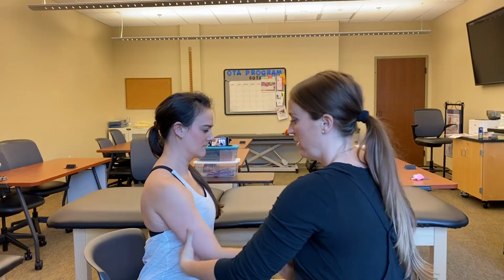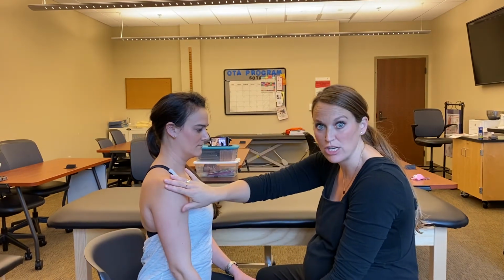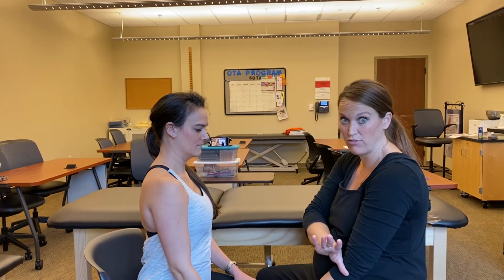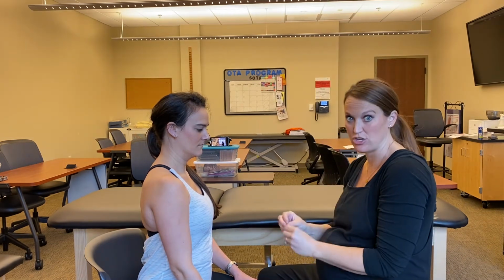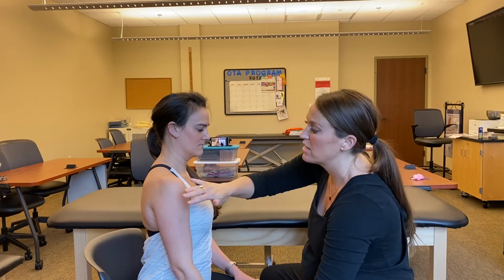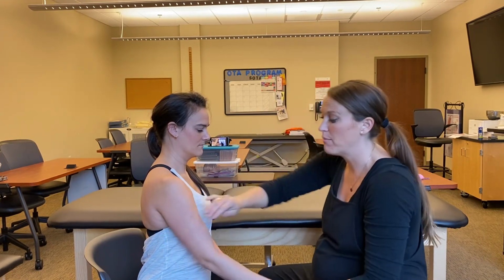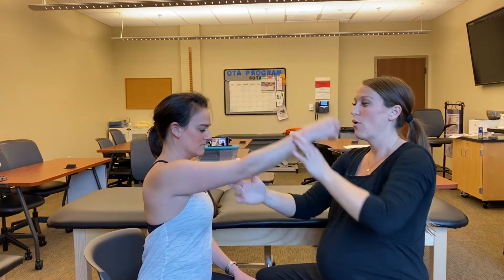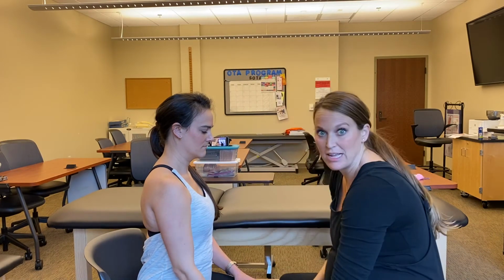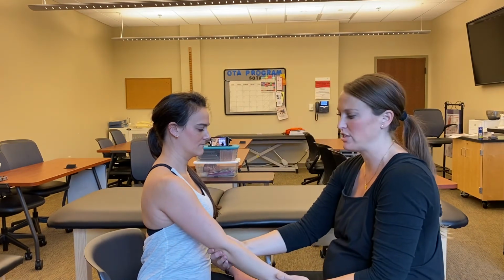Now, this is where our formula comes in. If passive range of motion is greater than active range of motion, then we know that there is a strength issue here. Courtney does not have the strength in her muscles to overcome the weight of her arm and gravity, okay?